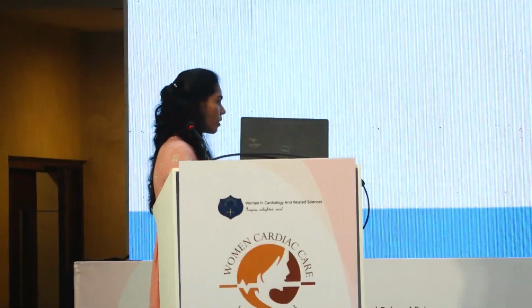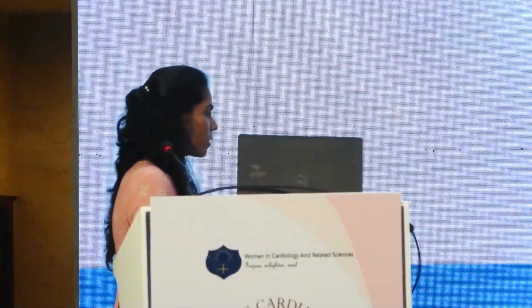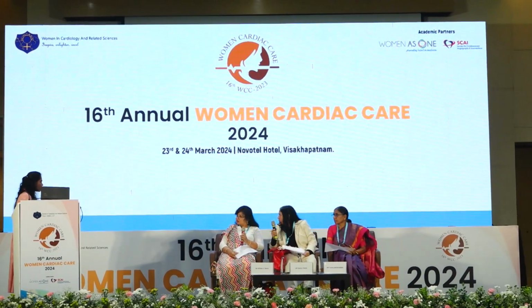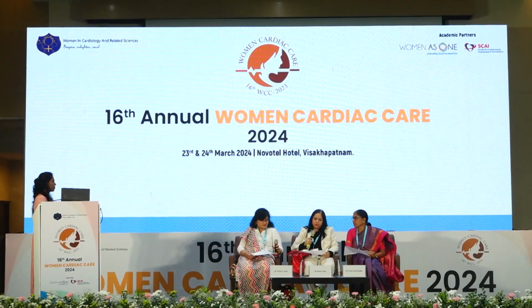We did it to the LCX because the future complication of ISR is more. In that case, you have to use a DCB, a drug-coated balloon rather than the plain balloon. So you did a plain balloon or a drug-coated balloon? Drug-eluting balloon. Drug-eluting, okay. Then it's good. Nice case.